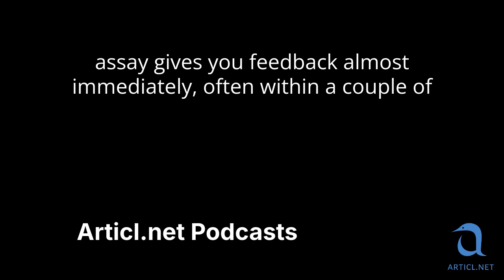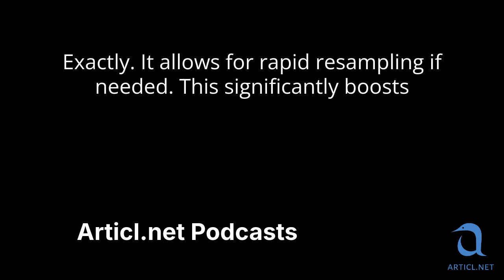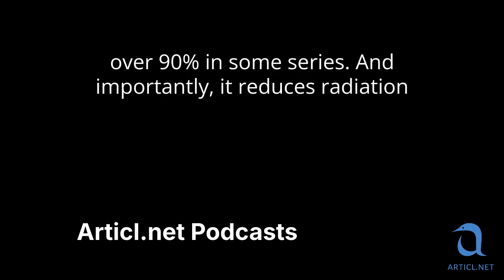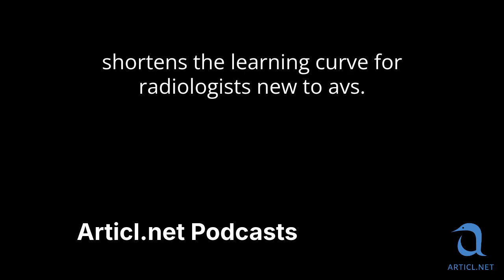Rapid cortisol assay, RCA, gives you feedback almost immediately, often within a couple of minutes, whether your sample is selective enough. So you know right away if you need to reposition and resample. Exactly. It allows for rapid resampling if needed. Yeah. This significantly boosts technical success rates, like from maybe only a third succeeding on the first try to over 90% in some series. And importantly, it reduces radiation exposure because you're not spending ages wondering if you're in the right spot or having to bring the patient back for a repeat procedure. Plus, it definitely shortens the learning curve for radiologists new to AVS.